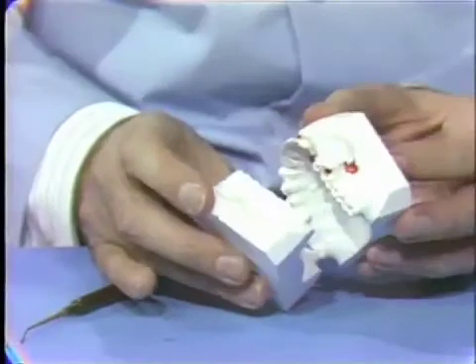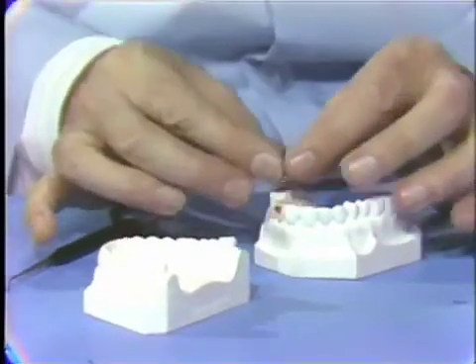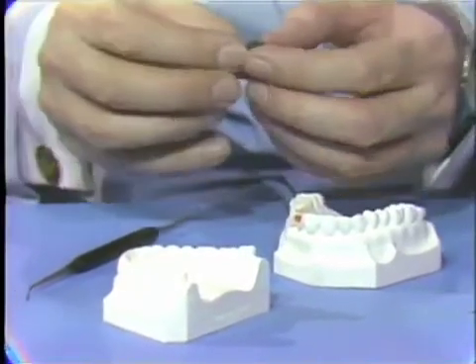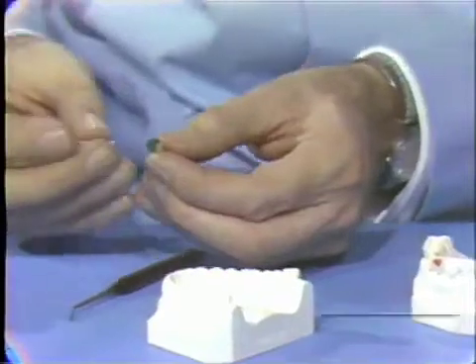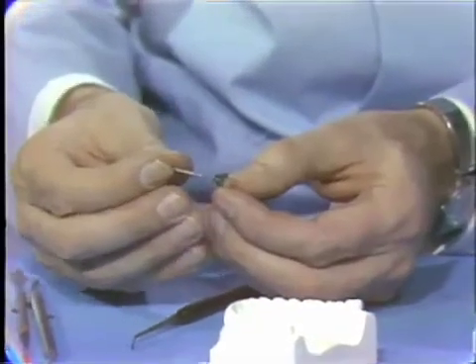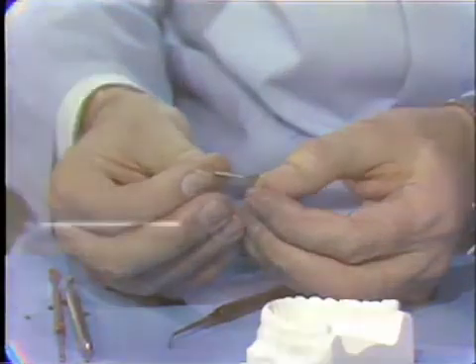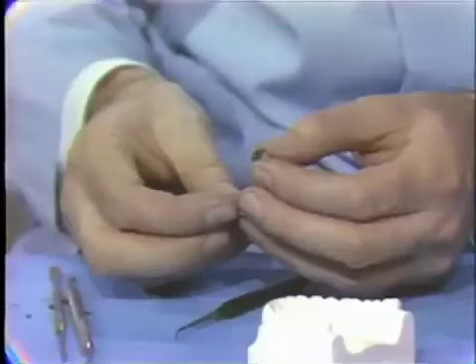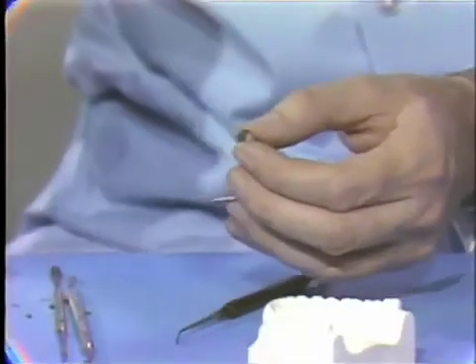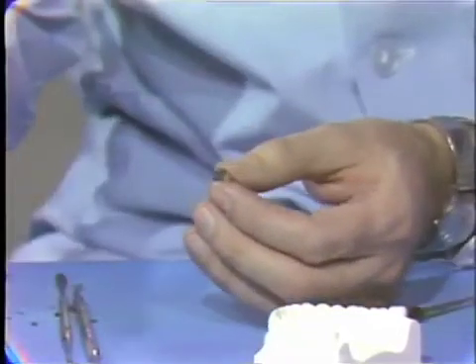So we now have the pontic waxed up, and it remains only to remove it from the model here and to sprue it and then remove the facing. To sprue it, remember that we're going to have to pull this off in the direction of that keyway, so it has to pull off in this direction. So we put a hollow sprue onto the cingulum area of the wax there to remove the backing from the facing.